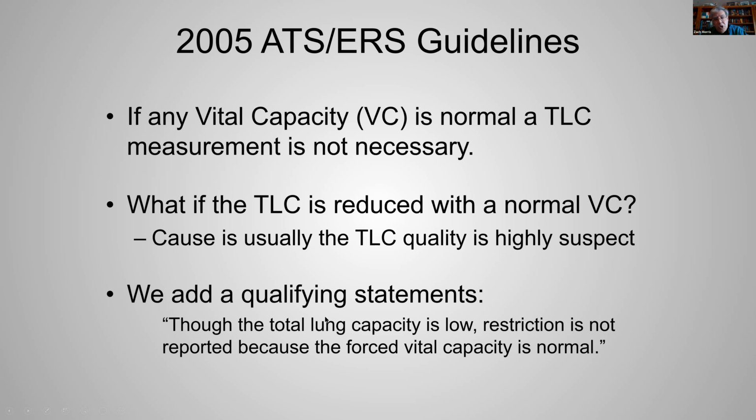When we see that situation, we're going to add a qualifying statement. We're going to say that though the total lung capacity is low, restriction is not reported because the forced vital capacity is normal.